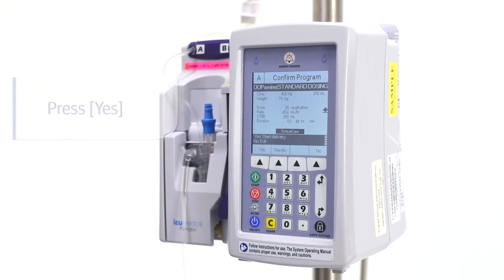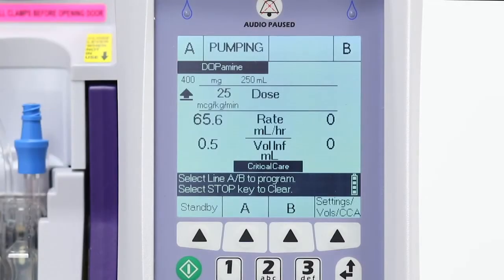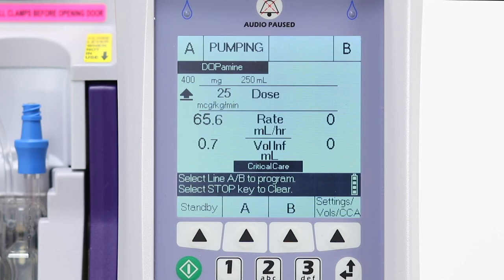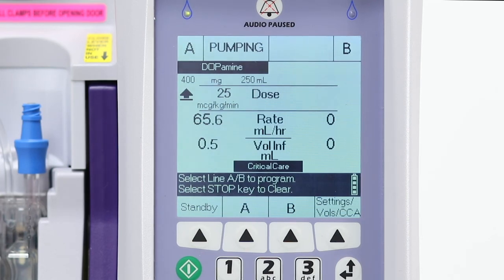The infusion will start, and the status of line A shows pumping. The flow indicator is flashing green, while the main delivery screen will display the drug name, dose, and rate. Also displaying on the delivery screen is the soft limit override symbol indicating the programmed soft limit, upper or lower, has been overridden.